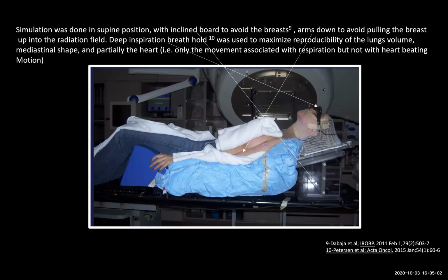The only way to achieve that is by feedback that the patient will give through looking at the goggles whenever they take a deep breath, rather than just coaching them with audio, because then the breath hold level and the volume of the lung would not be reproducible from day to day.